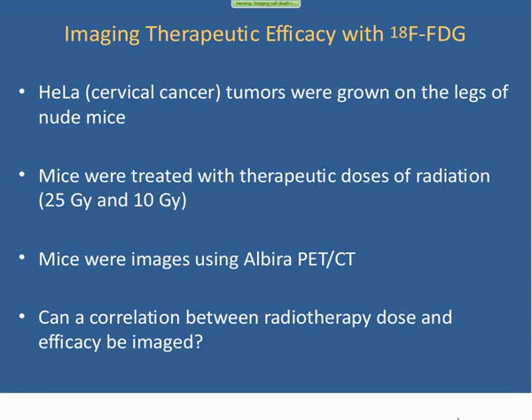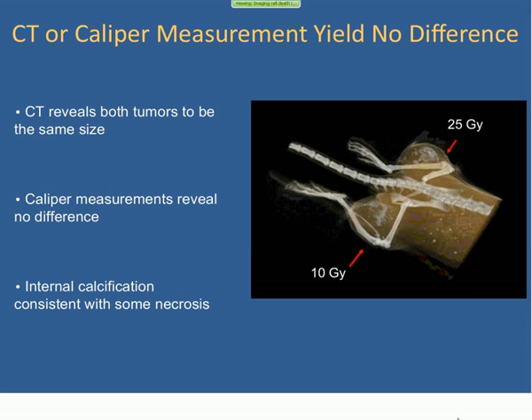So I'm going to show a couple examples of using FDG to perform three-dimensional imaging on the Albira trimodal system. So here you see a PET-CT fusion image of F18 FDG accumulated in a tumor-bearing mouse. So as I mentioned before, you see the X-ray, which is providing the three-dimensional scaffold, and you see areas of hotspots or localization of the FDG, and those include the kidney as well as the bladder. And here we have a tumor that's at the base of the tail that's also taking up the probe as well, and thus highlighting its location.